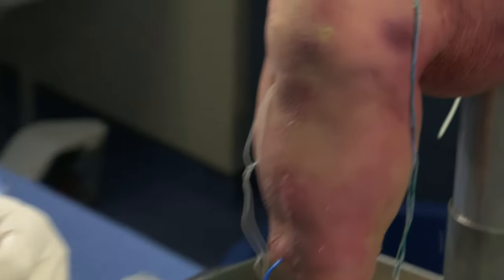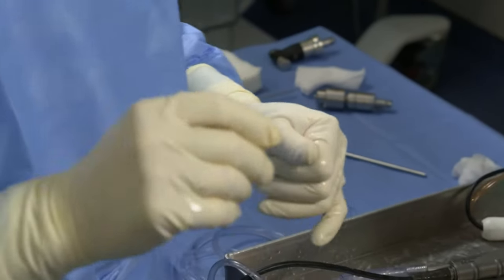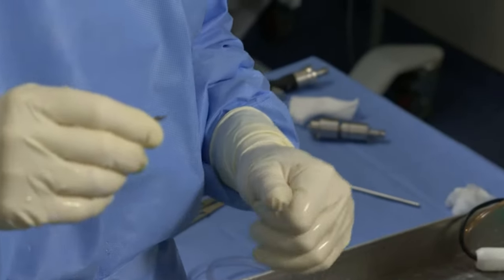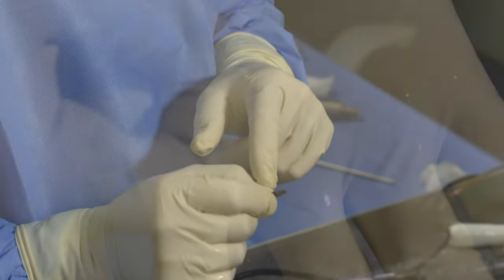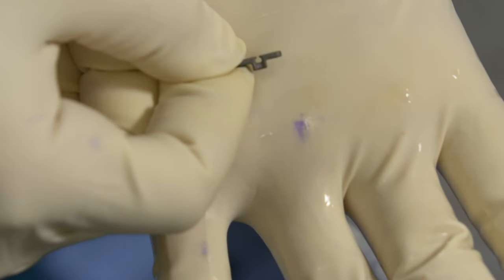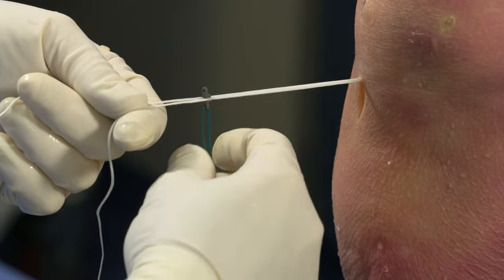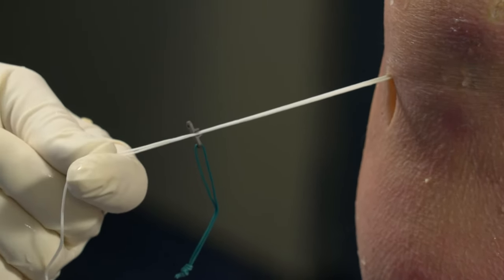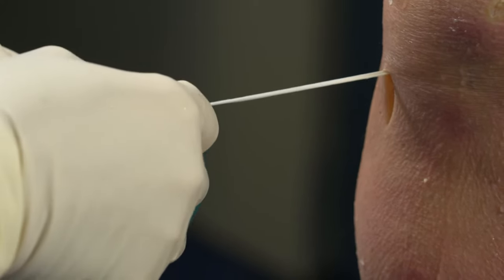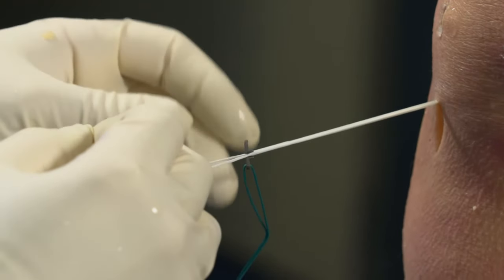Each clip comes with a little green suture that you can hold on to, because the tricky part here is placing the suture loop through this little eyelet — there's a little hole with a slot and that has to fit right between the two strands. Now we're locked in place. We can use this to orient ourselves for the small clip; I want to try to lay it transversely across the hole as we tighten it down. For the bigger one, I don't think it makes a difference.